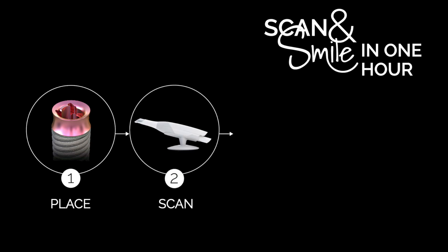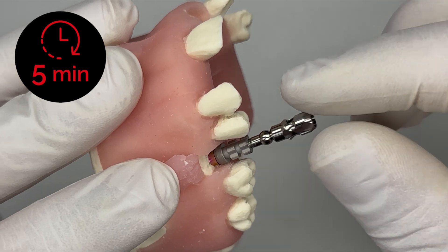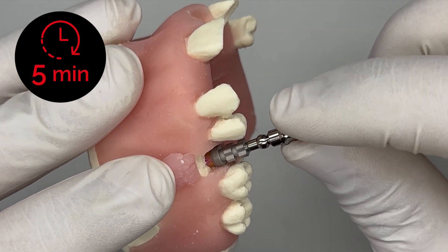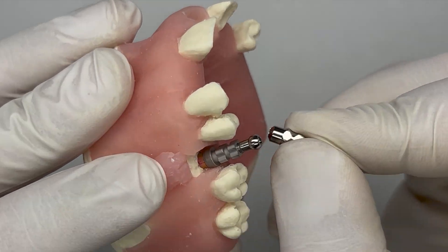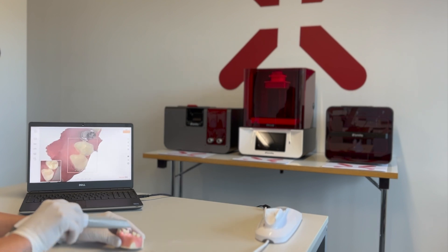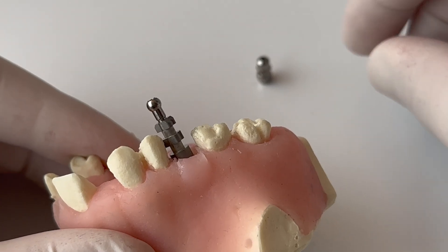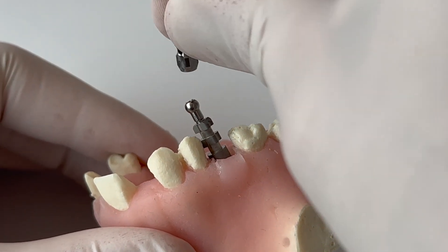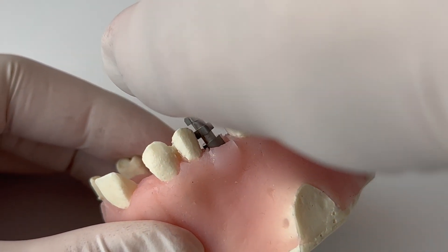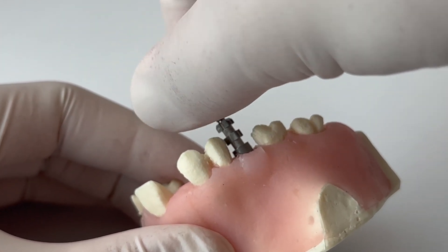Proceed on to step two with scanning. Screw the 3D Touch Scan Body hand tight onto the implant using the integrated handle and then break it off. The situation is ready to be scanned with an IOS of your choice and a standard STL file can be created. After scanning, rotate the broken handle 180 degrees and stick it frictionally onto the 3D Touch screw head at any angle up to 45 degrees and unscrew the scan body.